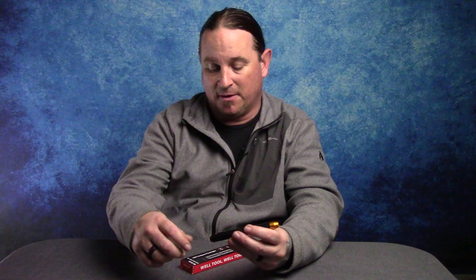How's it going everybody, Harold with Buckeye Reviews. I am finally back. I took a nice break from YouTube and I am here with a new light. This is the Weltool — I believe the model number is the M6 series, also known as the Golden Eye Tiger Cub.